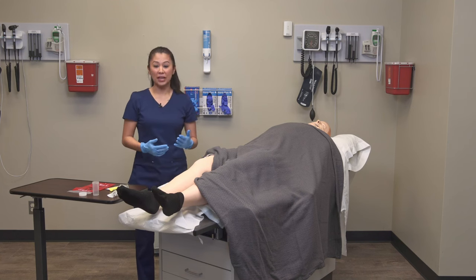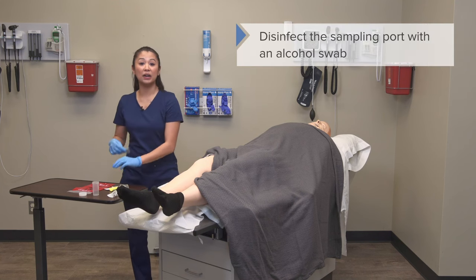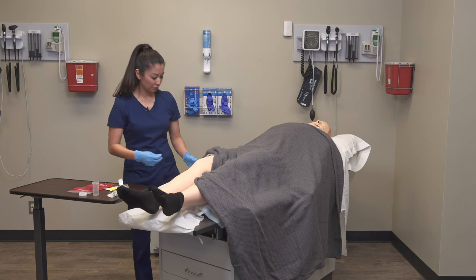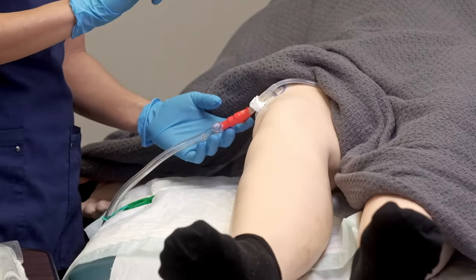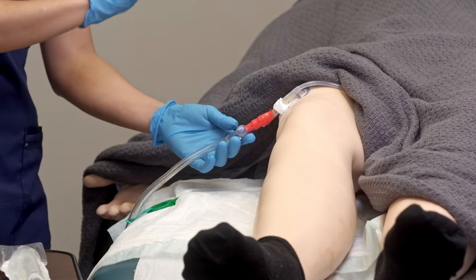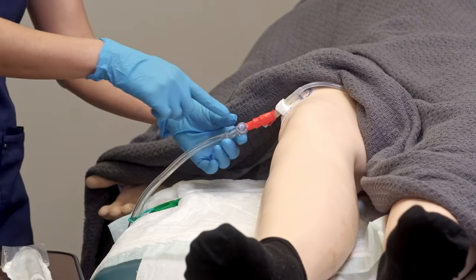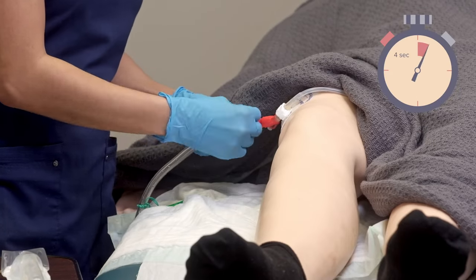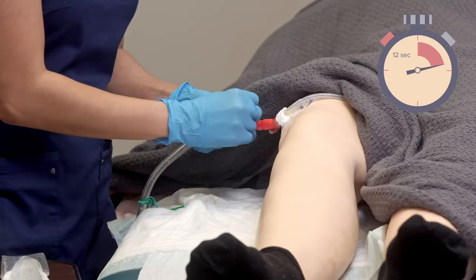Once I've done that, I'm going to take my alcohol swab and disinfect the sampling port here. Just as a reminder, this is our balloon port — this is not what we're using in this case. We are using the sampling port here, and I'm going to clean it with my alcohol swab and make sure it fully dries.